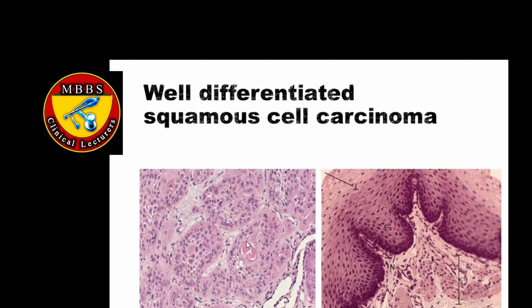This keratin formation is very important. This is the identification point of a well-differentiated squamous cell carcinoma.